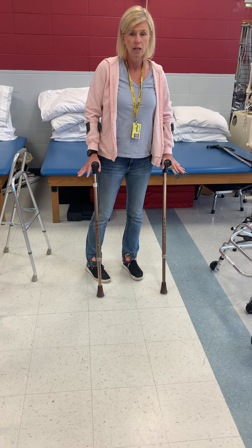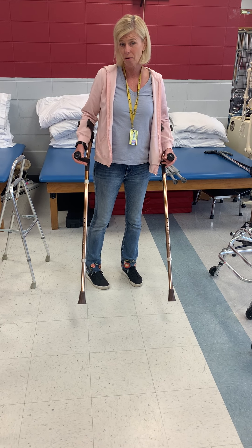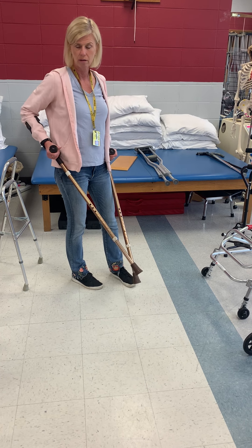But if somebody is going to be on them for a long period of time, they learn to use Lofstrand crutches pretty quickly.